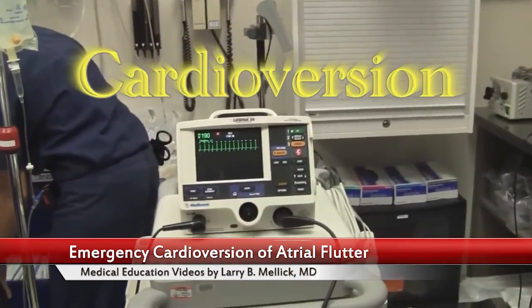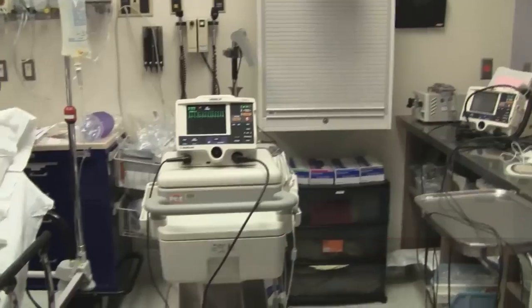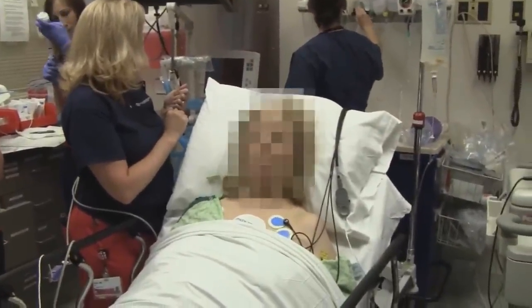We're going to be doing a cardioversion here. We have an atrial flutter going on. So this is our patient — we're going to blur her face. Can you tell me a little bit about when this started?